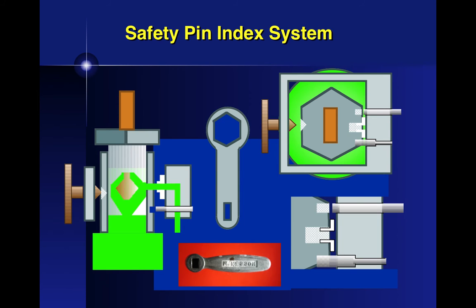I look at the machine. She's on 2 liters of nitrous, 8 liters of oxygen, so it's only a 20% mixture. She shouldn't be asleep. I got my blood pressure cuff. Her blood pressure was quite normal. I give it a minute. She's still asleep. No eyelid reflex if you touch the eyelashes. If the patient's conscious, you'll normally see a little flutter. My IQ is dropping like a rock because I don't know why this woman is unconscious. I'm beginning to think stroke, and in a minute or two, I'm going to have to call the paramedics.